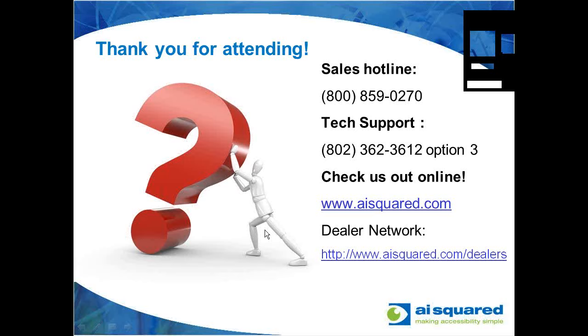I had a question via email about if you can view larger things with this. And what's great about the ZoomText camera is because it's so flexible and you can move that arm. I mean, it's over 2 feet long, I believe, the arm. So you can move that. If you get a giant box in the mail, you can certainly adjust that arm and you can see it on your computer.